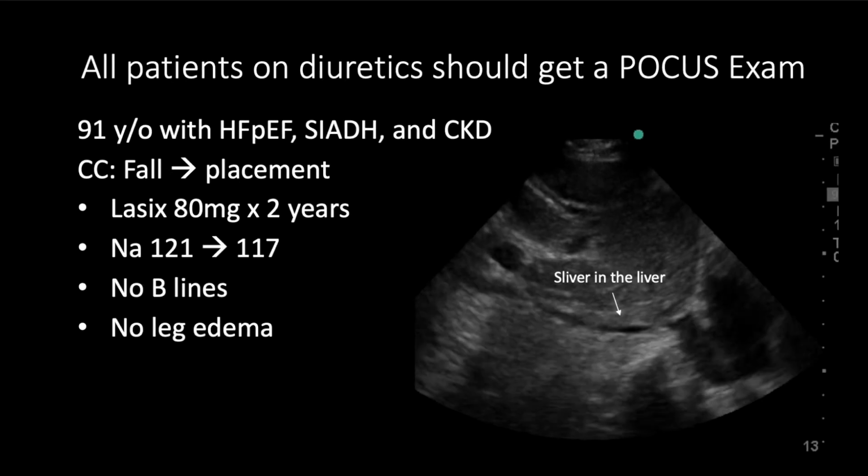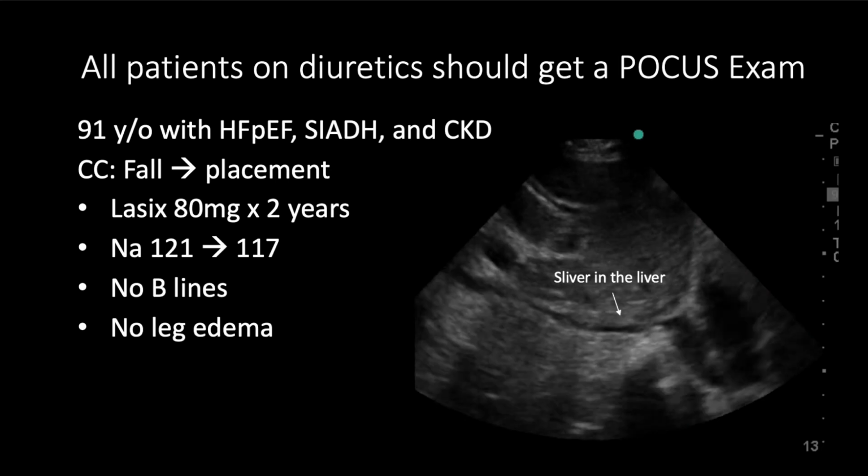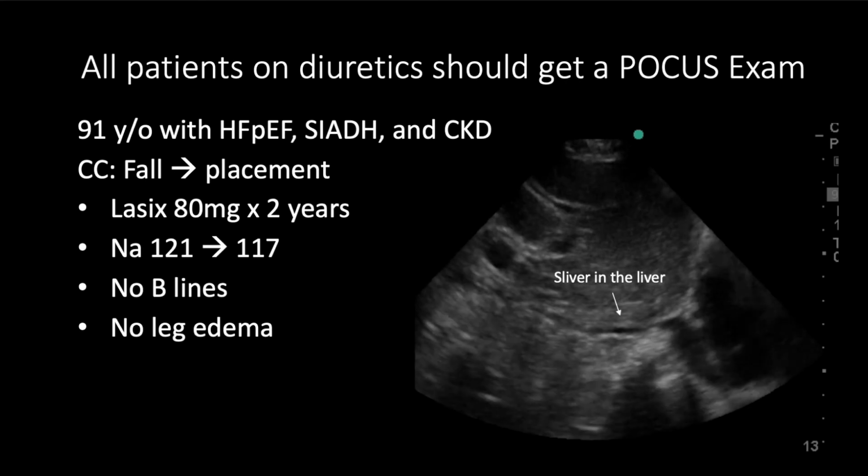The take home from this case is really all patients on diuretics should get a POCUS exam. Even if they're not complaining of volume status issues, I think it's important to routinely check in on patients on diuretics to see what their volume status is.